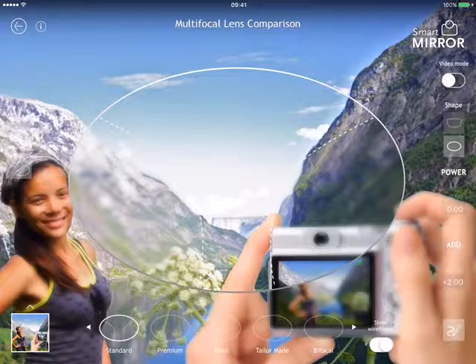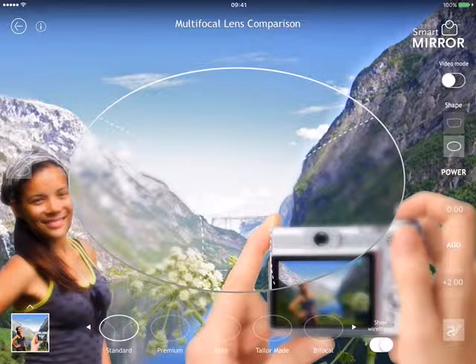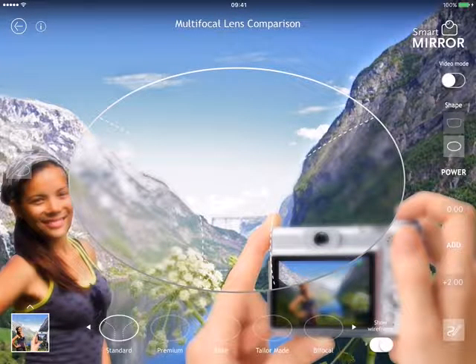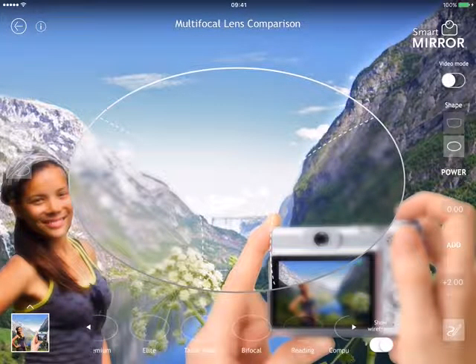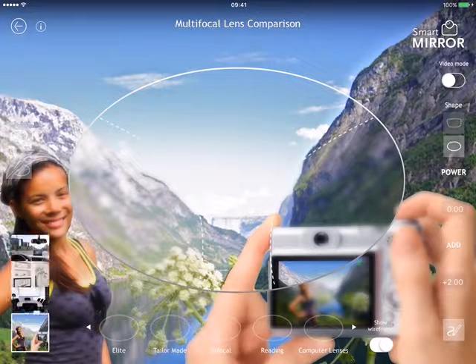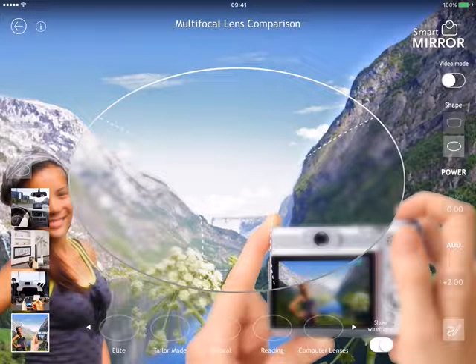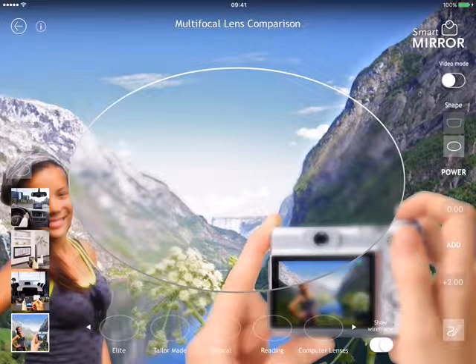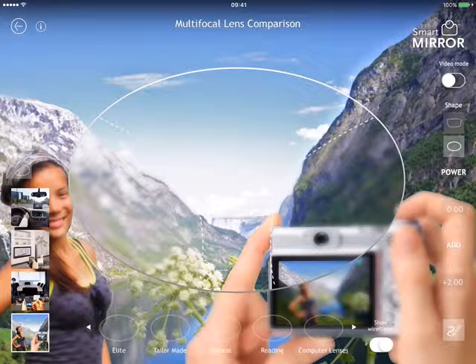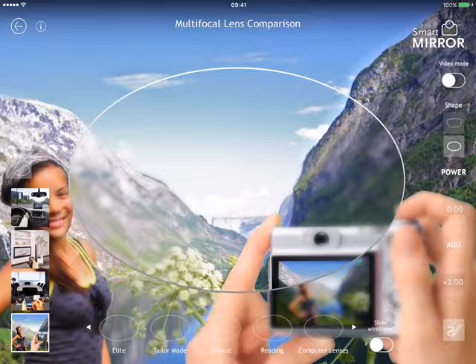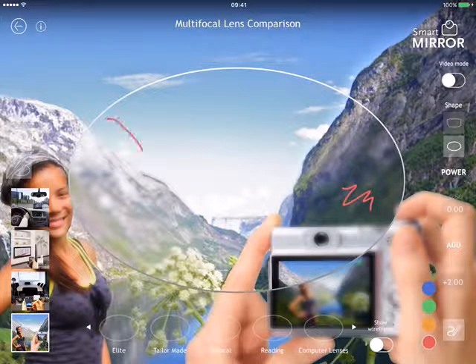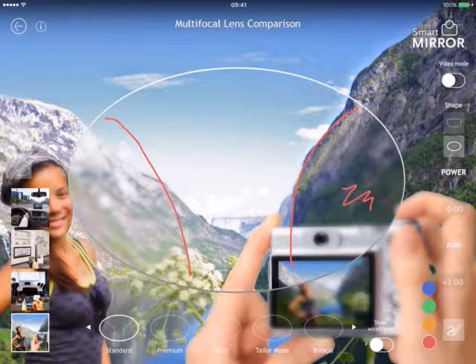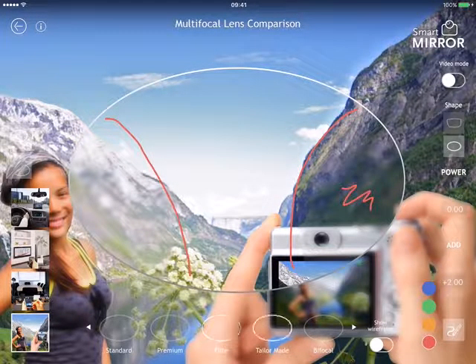Multifocal lens comparisons: we have four progressive designs — standard, premium, light, and tailor made — which we can customize for your business, like your brand of lenses. One bifocal, one near vision, and one computer vision. We have three images. You can choose to show the wireframe to display the distortion in the peripheral and nasal area, and switch it off if you don't need it. You also have a pen tool to highlight the distortion area — for example standard, premium, light, tailor made.